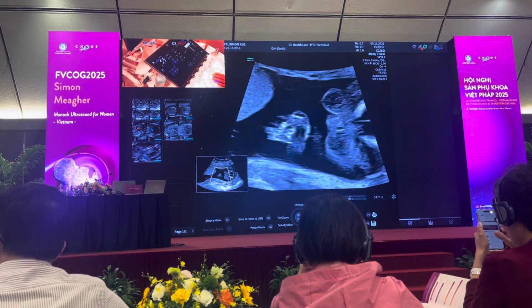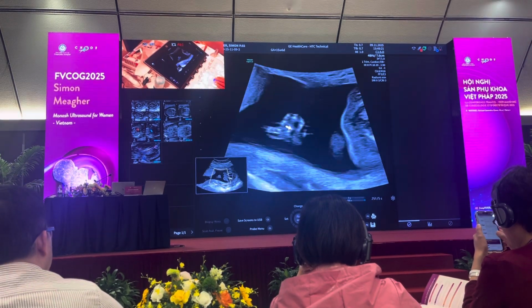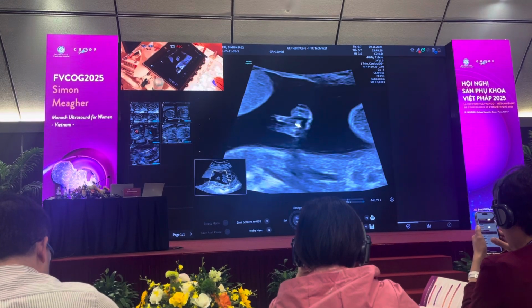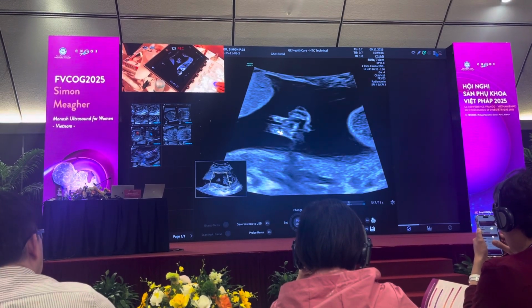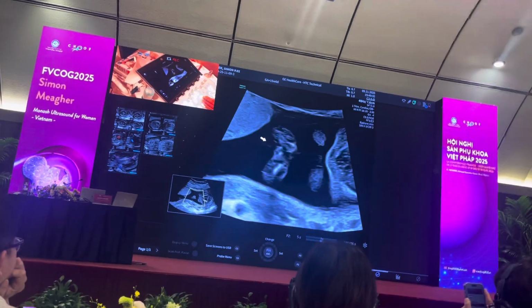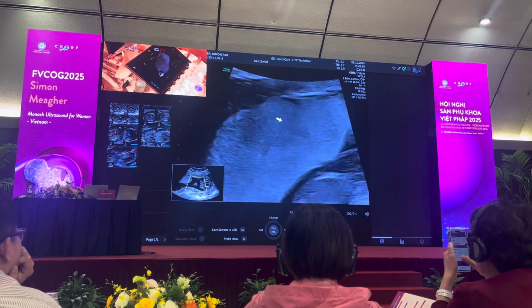Coming back to the baby's hands, the hands now look normal to me, and I think the baby was just stretching his fingers. When I look at this, I can see the fingers on both sides. I don't think there is a single digit missing. I can see 3 fingers there beside each other, but I do not think that they are reduced. And that's it. I think we better go back to the lectures.